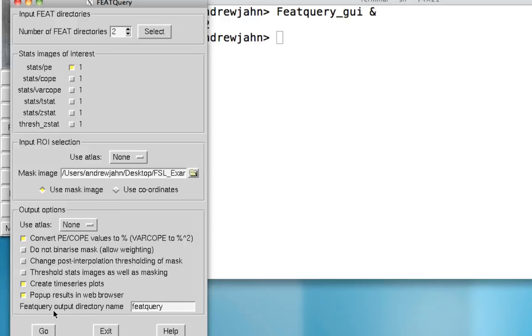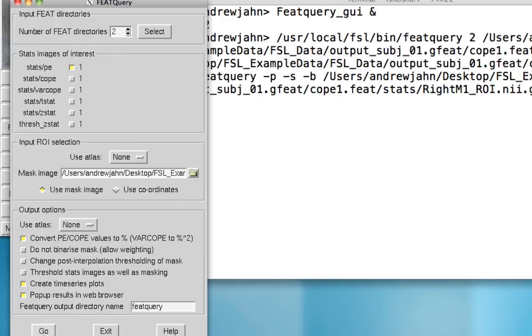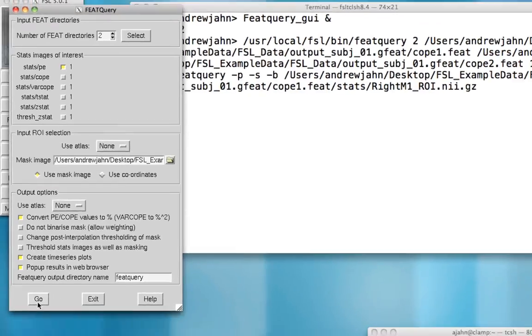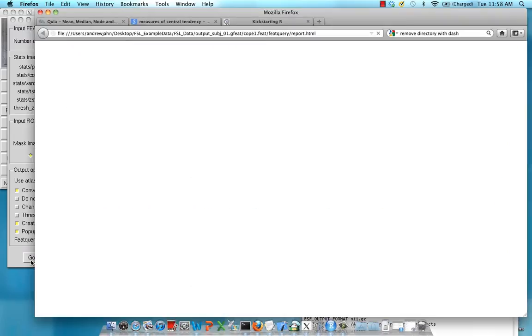And lastly, the output directory name, we'll just call that featquery for now. When you hit go, notice that this pop-up browser comes up.